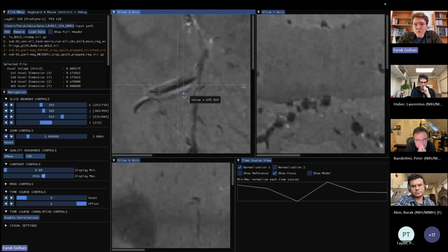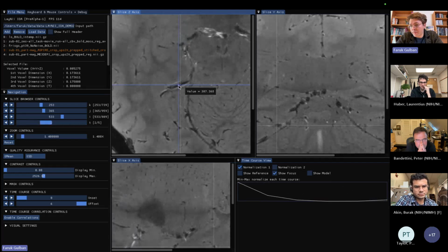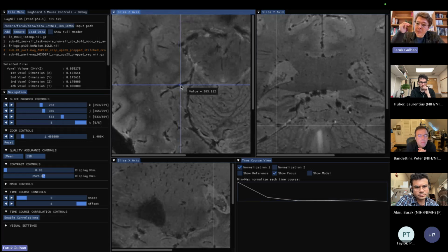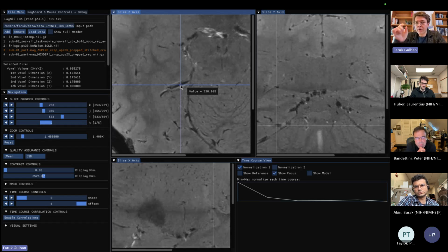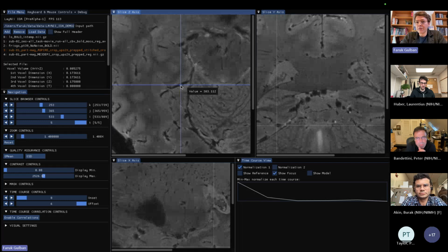I would like you to notice something strange here, and that is this white halo that is around the dark tube. This is actually something I talked about 2 years ago when I was at NIH. This is the blood motion artifact. When the blood is moving so fast inside your large arteries, and the time difference between the phase encoding and the readout stages increases, you end up seeing, particularly in GRE data, where you have very short readout times, this white arterial signal going out of the artery itself.